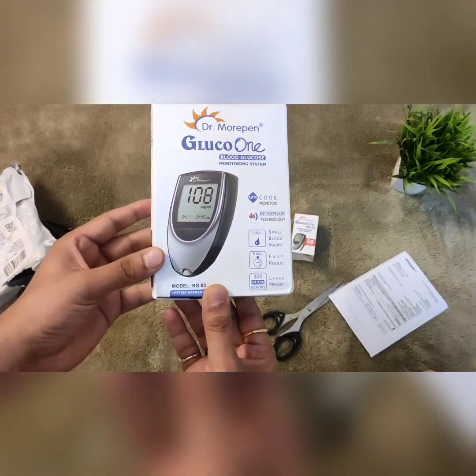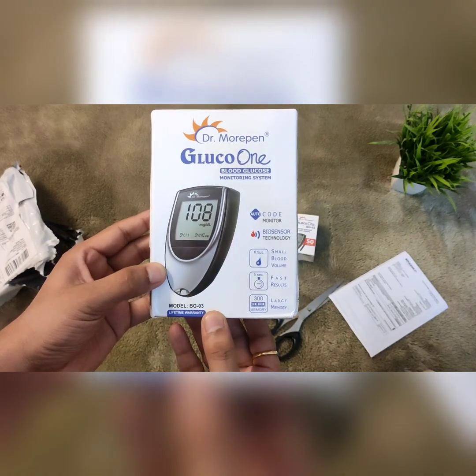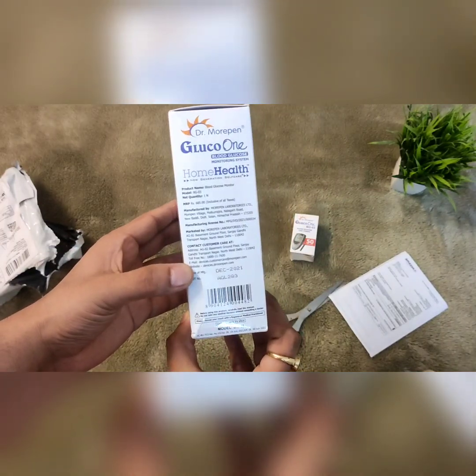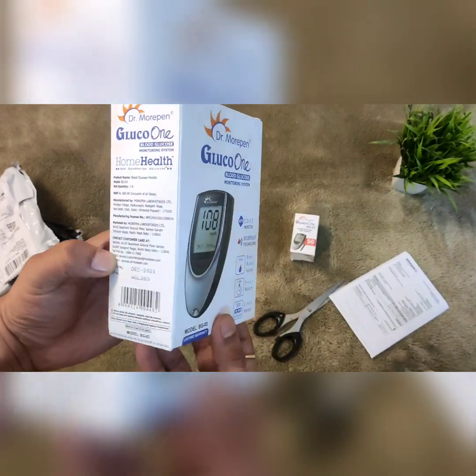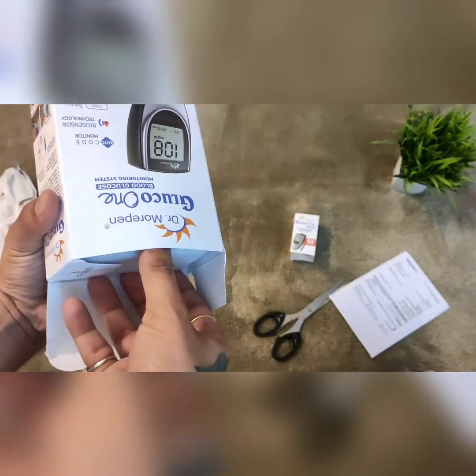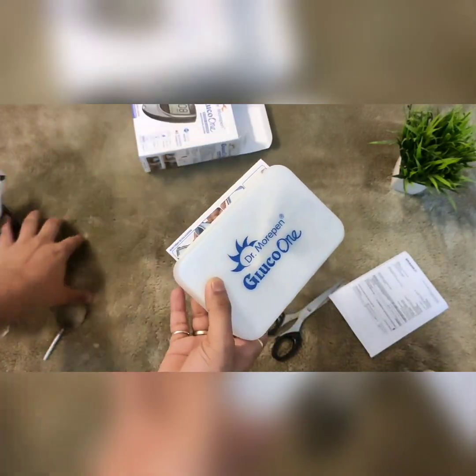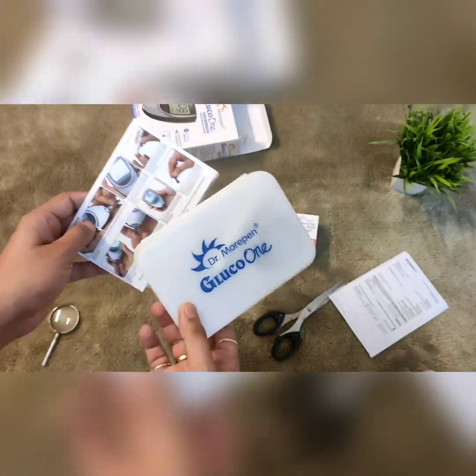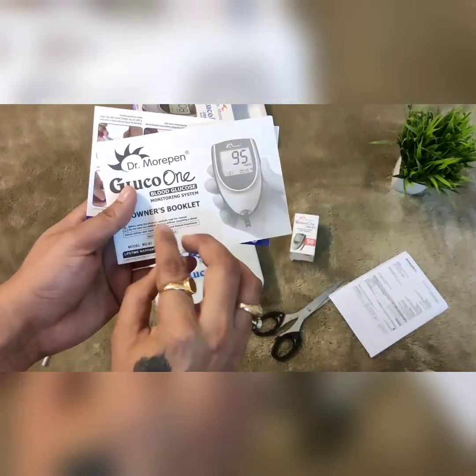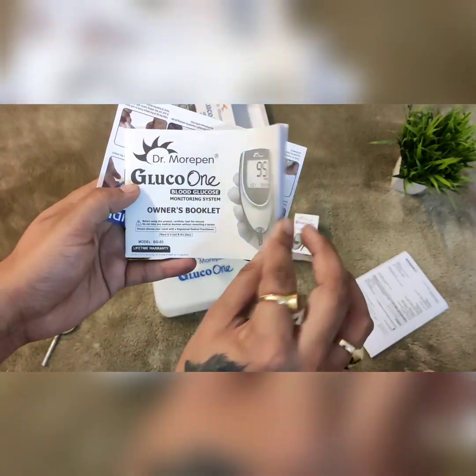Here comes the new Dr. Morepen's Gluco One blood sugar monitoring system, model number BG03, as we have already described previously. Here you can see the packing and the guide booklet which we have received showing how to use this device.